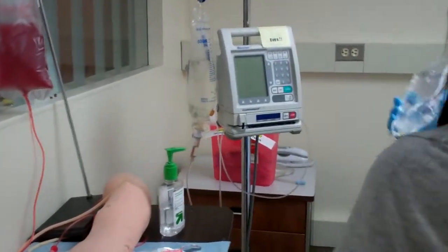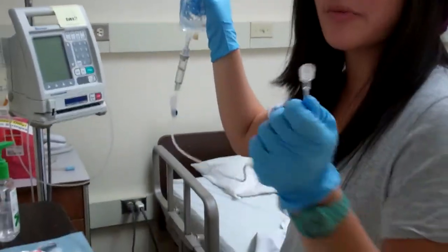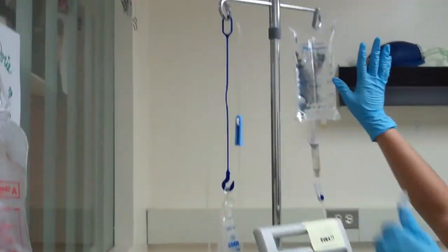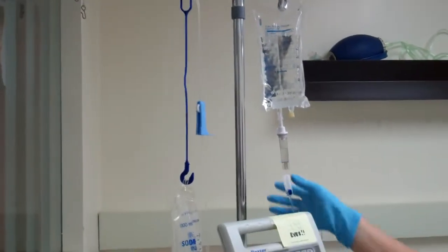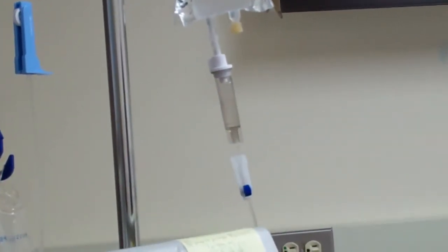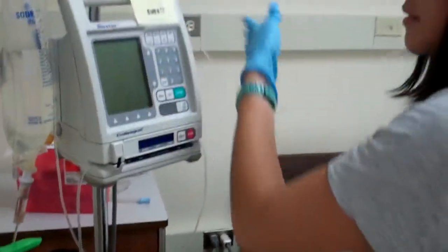So now this would be my secondary bag, my medication. I would hang it above my primary, fill up the drip chamber to about halfway, and then prime my line, getting out all the air bubbles.